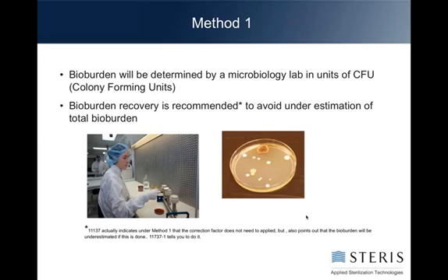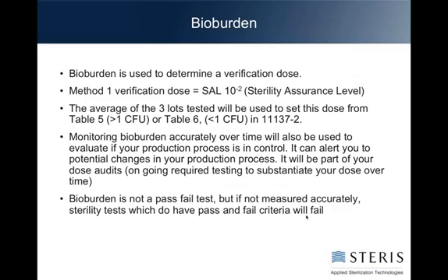In the old days, many times people did not do recovery efficiency with Method 1. In the last 10 years, I haven't seen anybody not do it. So don't think of the terminology as a way of avoiding a test. Think of the previous test as one that really is to your benefit to do.